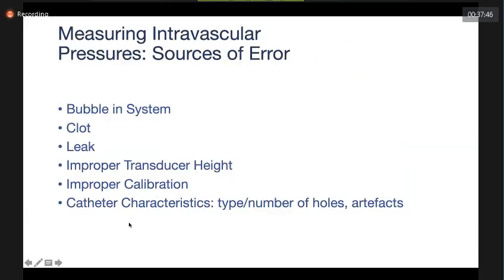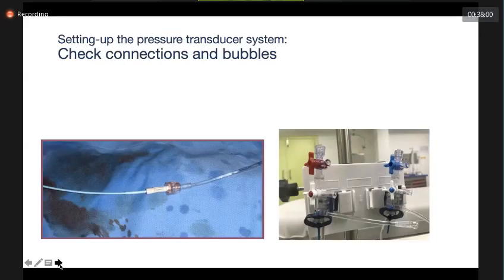So your catheter and tubes are going to be very essential to check: what kind of catheter material you are using, and how you are going to record the pressure. Check the connector. Here, the connector is used without a three-way. That is good, provided there are no bubbles and no clot, because you are eliminating one connection, so you will have complete pressure recording.